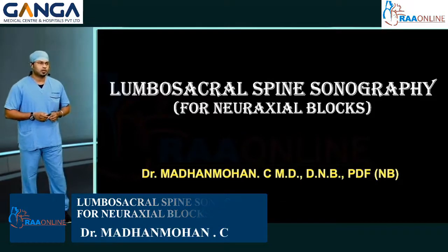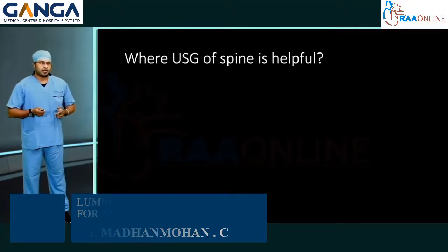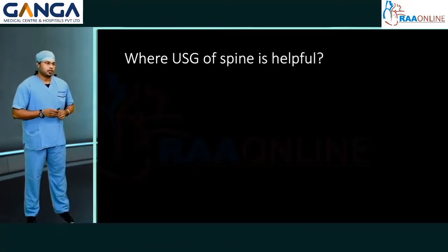Myself, Dr. Madan, will be discussing lumbosacral spine sonography, where ultrasound will be helpful in neuraxial blockade especially. For the past more than 4 to 5 decades, lumbosacral neuraxial blockades have been done based upon the landmark technique. But there are some special situations where the landmark technique will be difficult or will lead to failure. In those situations, ultrasound will be very handy and will give you an appropriate idea about where to put our needle in order to reach the neuraxial space.